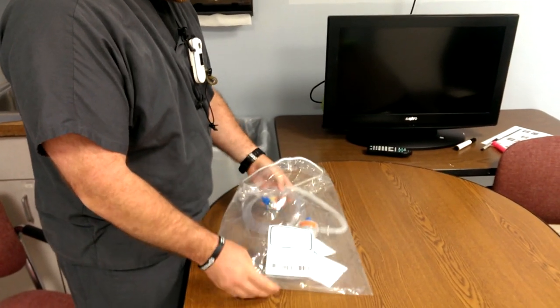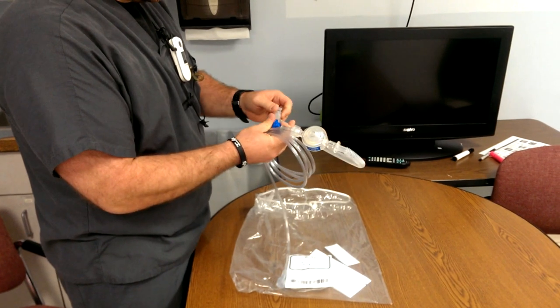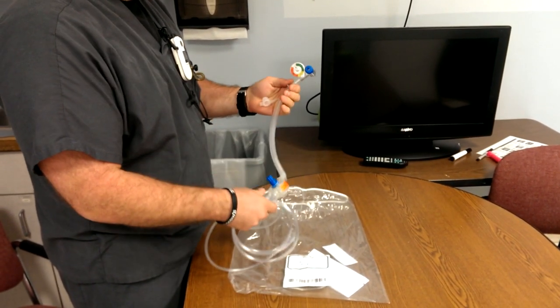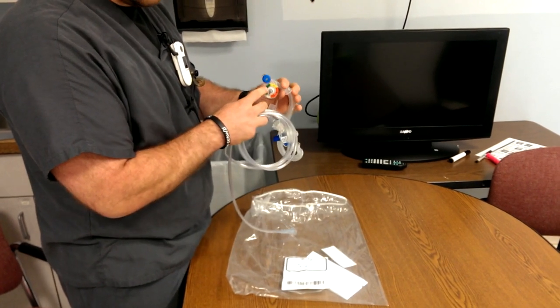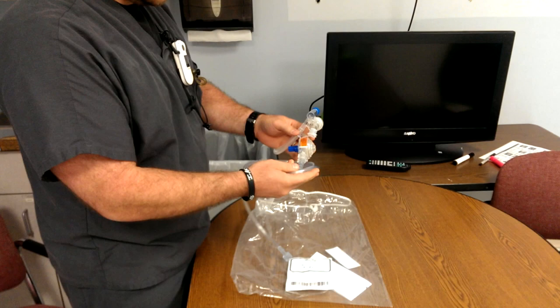I'm going to show you how to use the NEO-T. This is a T-piece resuscitator used for neonatal resuscitation. The advantage is that you're monitoring the pressure for each breath you give, so you're not going to give too much pressure and cause a pneumothorax.